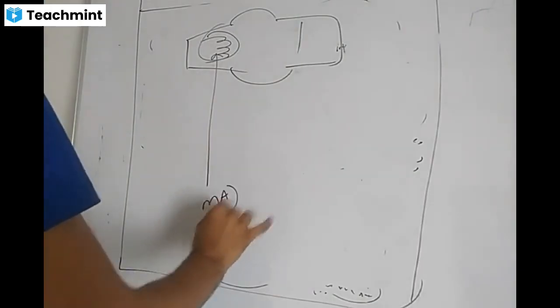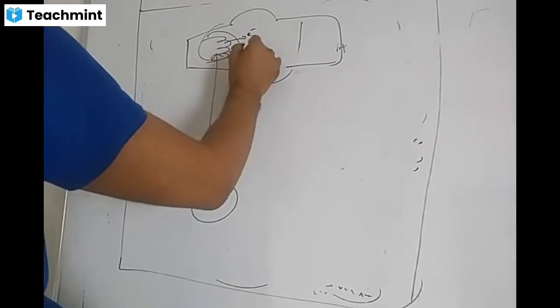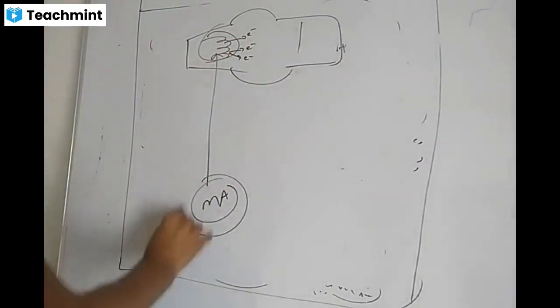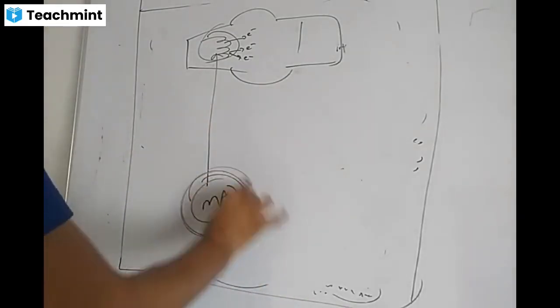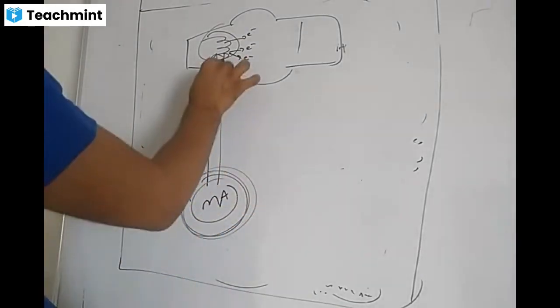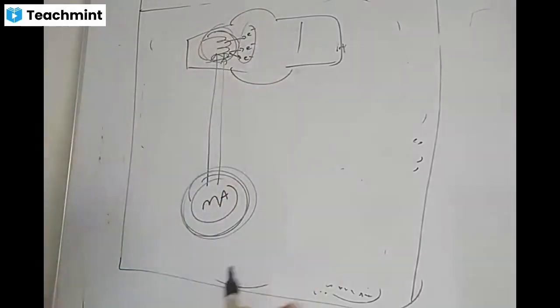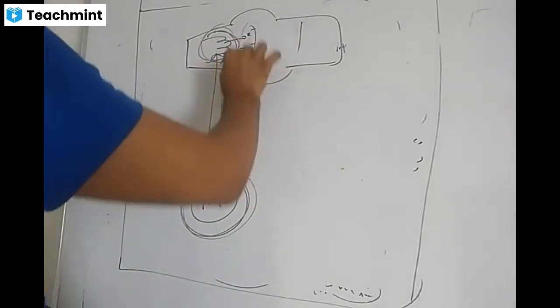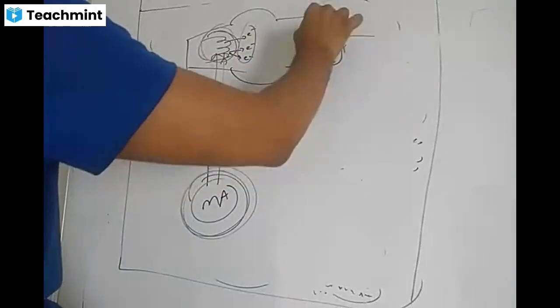Suppose you give milliampere to me, I will give you electrons in return. From the outside, on our machine, we can increase or decrease our mA. So we give the mA, and the tube says, I will give you electrons. Then the tube says that I'm not going to move these electrons towards the anode.